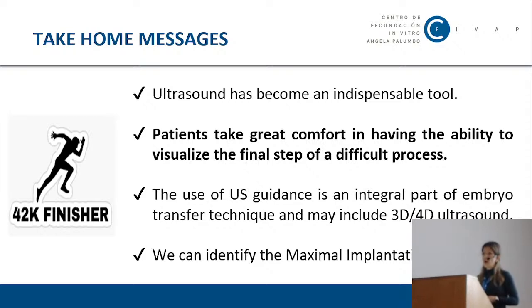The use of ultrasound guidance is an integral part of a perfect embryo transfer technique and is only expanding and may include 3D and 4D ultrasound guidance. And to answer our initial questions, yes, I believe, and we believe, that we can identify the optimal implantation point.